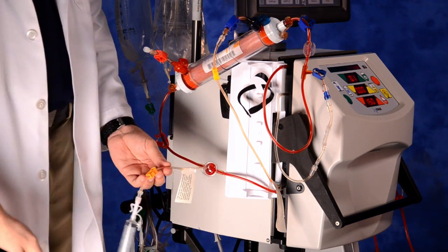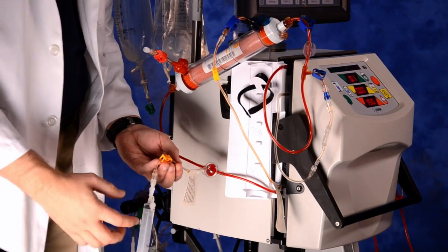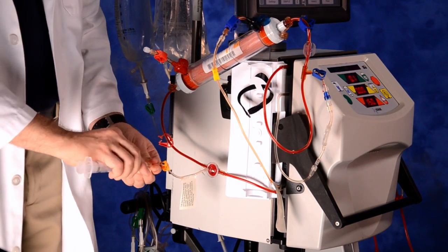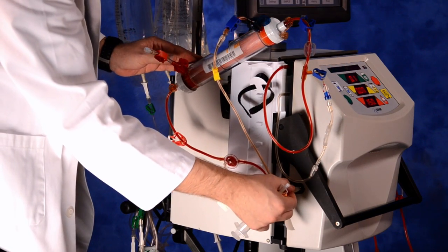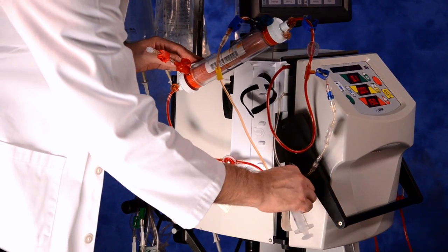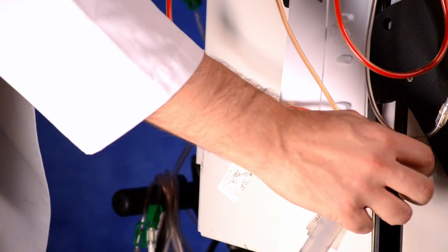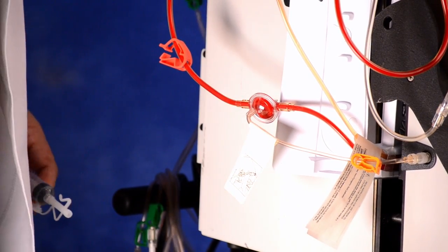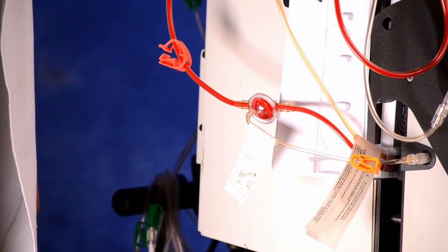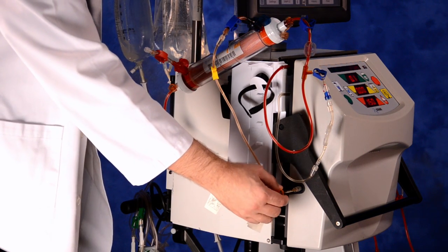Press the green treatment key on the cycler interface. Reconnect the filter pressure monitoring line. Fully insert the filter pressure monitoring line tip into the connection point on the cycler, turning one quarter turn counter-clockwise while pushing in. Then tighten the locking collar clockwise. This allows for proper connection of the pressure pod. Unclamp the filter pressure monitoring line orange clamp.